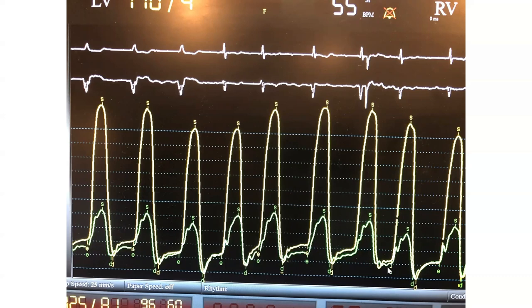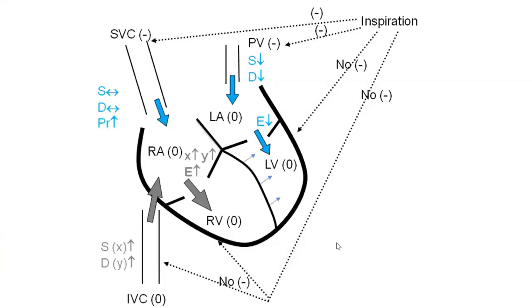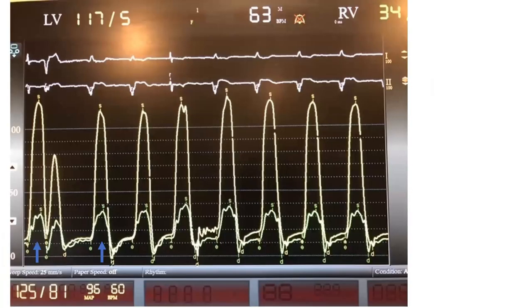Normally in hemodynamics we prefer quiet breathing, except in constrictive pericarditis — here I want to exaggerate the respiratory discordance. Ask the patient to take deep breaths in and out repeatedly; this creates more negative pressure and more septal motion, making the dips and bulks fluctuate more. Note that deep respiration can occasionally create discordance in patients with severe lung disease or morbid obesity.